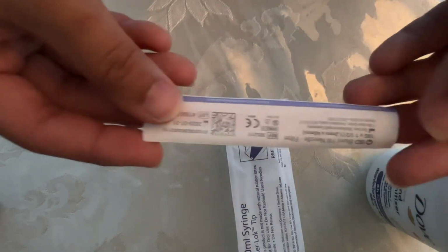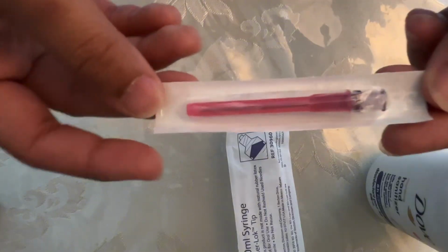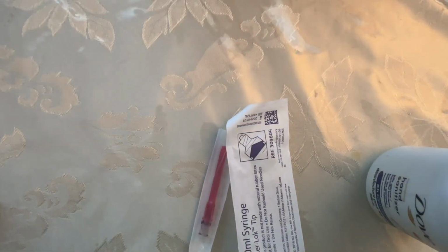So into the medication room, the nurse needs a hand sanitizer, a 10 ml syringe, make sure that it's dry and intact, an 18 gauge blunt needle, make sure that it's dry and intact and not used, and some alcohol swabs.